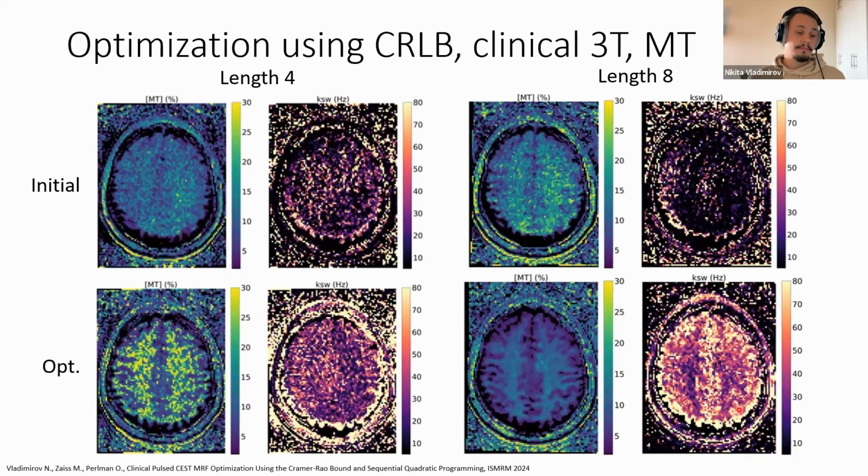It's really promising, but the absolute values of, for example, gray matter or white matter are a little bit off from the literature. Overall, we have a ground truth method, which is the big sequence with 30 images, and compared to it there is a statistically significant improvement in the correlation between before optimization and after, and in other metrics like PSNR and so on.